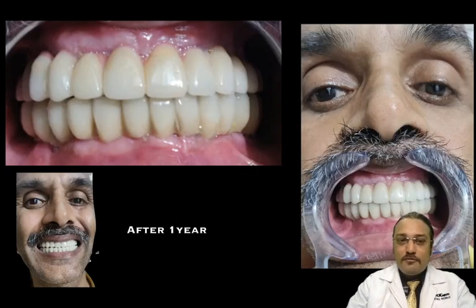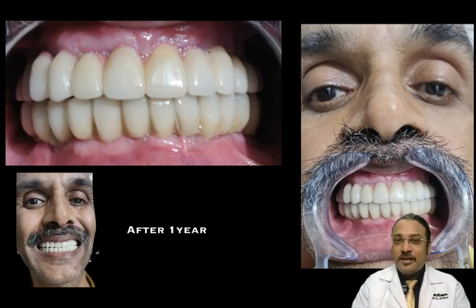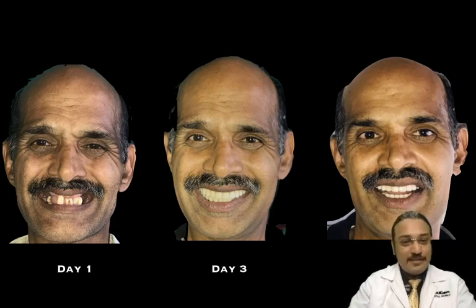That's the 1-year follow-up of the patient. Can you appreciate the very good healing around the teeth and around the implants in both the upper and lower jaw, and the patient is maintaining it extremely well. There is no problem with respect to healing. So that is absolutely well.